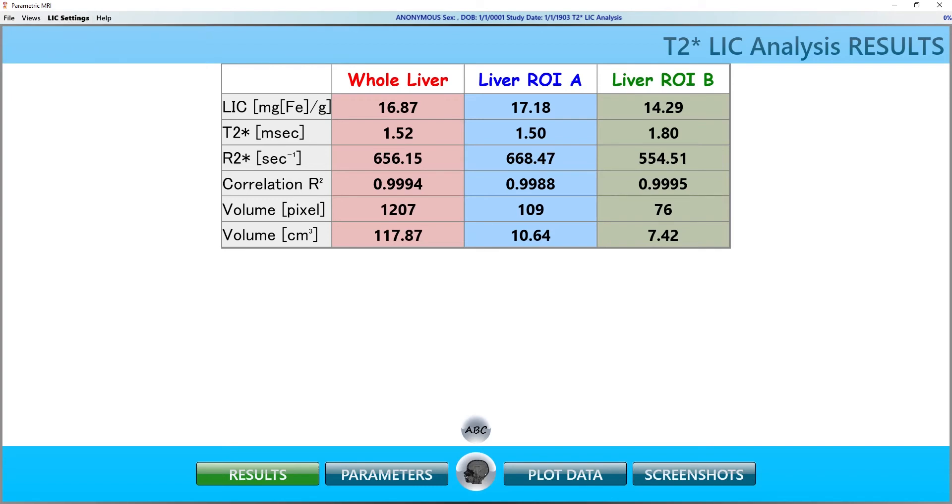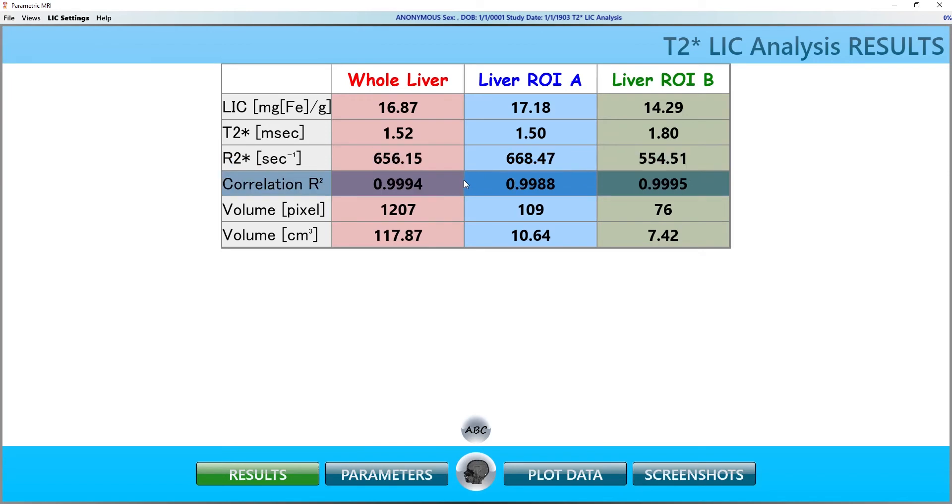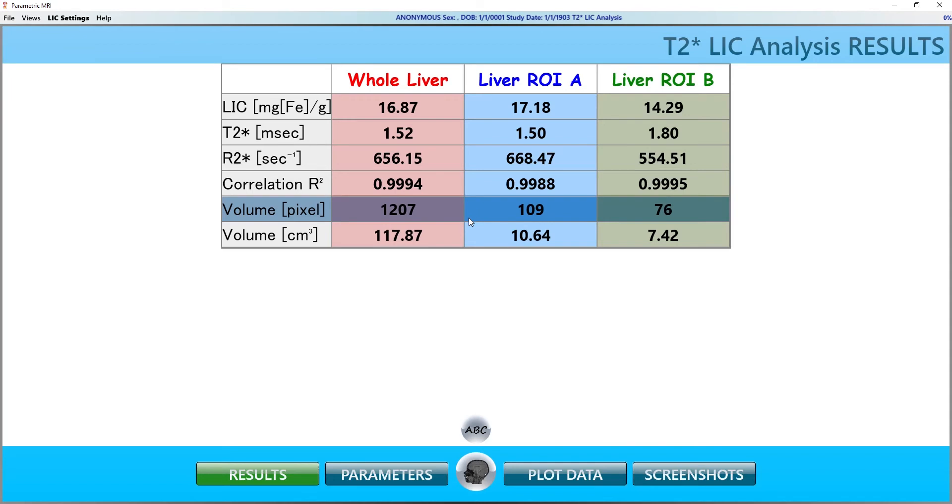Next, we have the mean T2 star value in milliseconds, the mean R2 star value, the correlation of the R2 star fit, the volume of the ROI in pixels and the volume of the ROI in CCs.